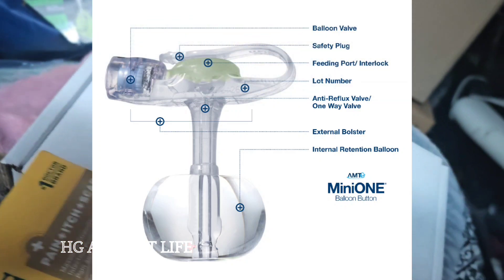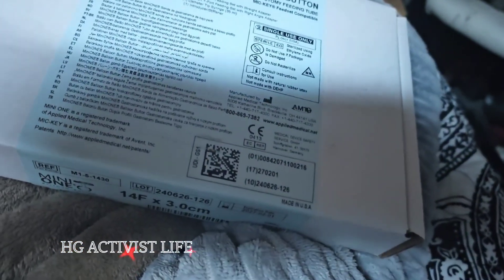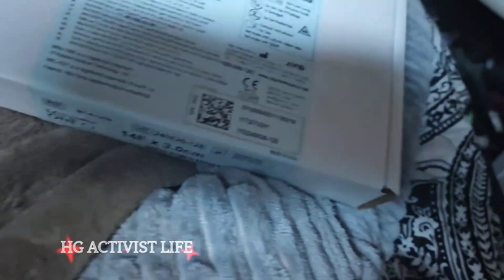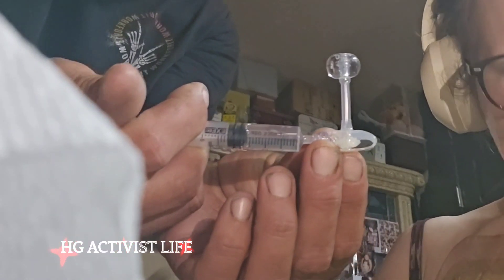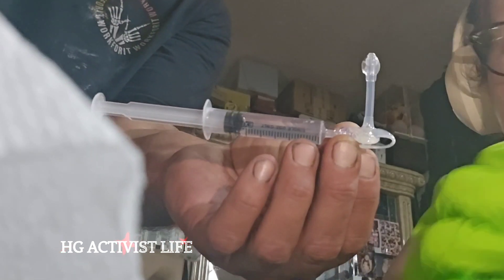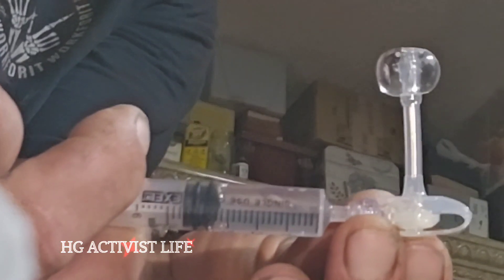For a J-tube, I have friends that change their own button, but I also have friends that go to radiology for every tube change. You want to check the balloon and make sure that it doesn't have any leaks and that it's not faulty — this is a very important step that many people forget to do.